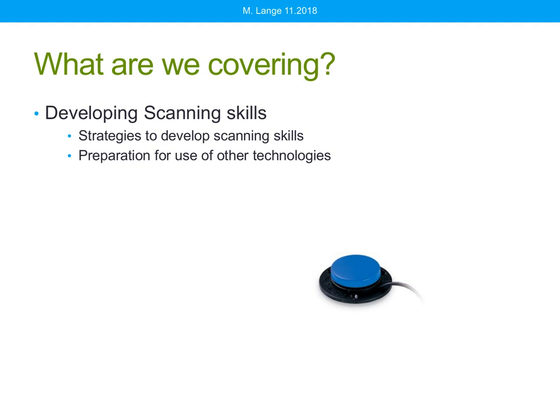So today we'll be talking about developing scanning skills. The skills that are required for someone to scan through their options on a variety of assistive technology are not very intuitive, and often an individual client will have much better outcomes if they have a chance to actually practice and develop these skills before it's transferred over to that technology.